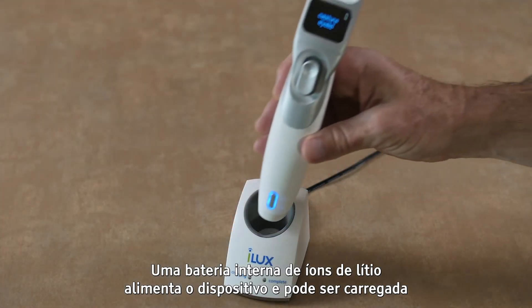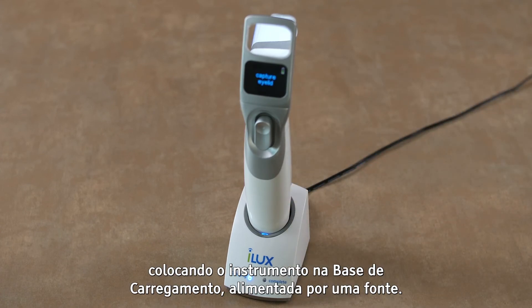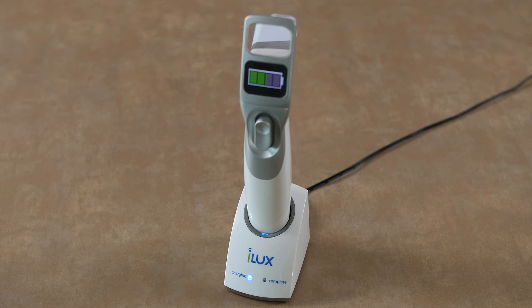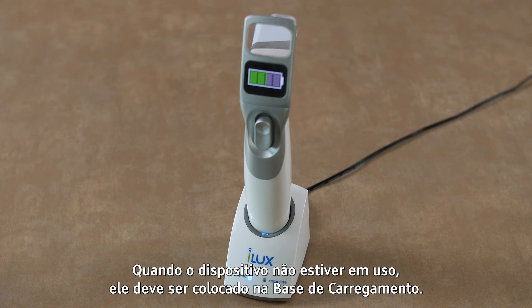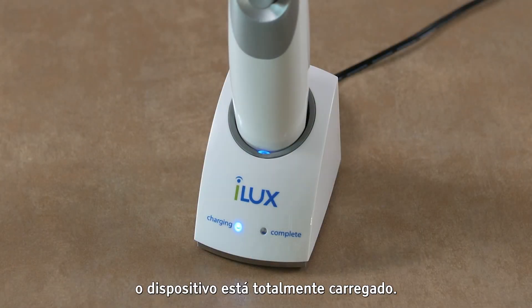An internal rechargeable lithium-ion battery powers the instrument and may be recharged by placing the instrument in the charging stand powered by an AC power supply. When not in use, the instrument should be stored on the charging stand. When the light on the charging stand is green, the instrument is fully charged.